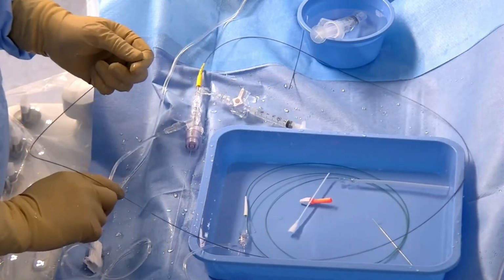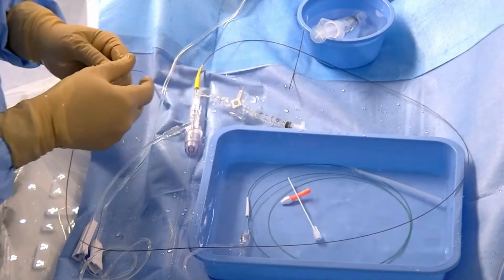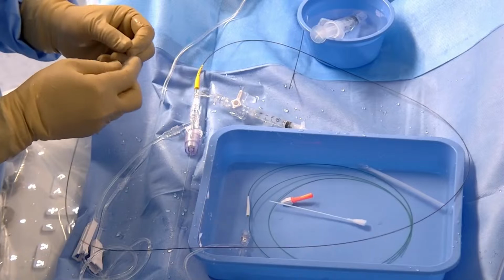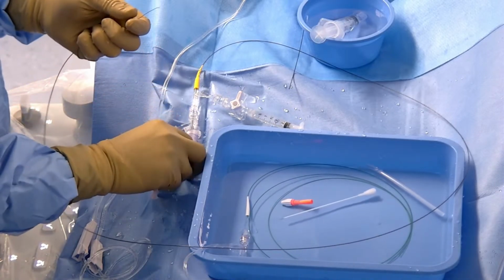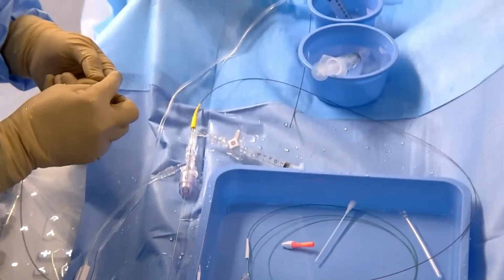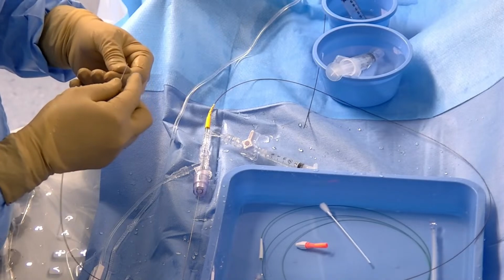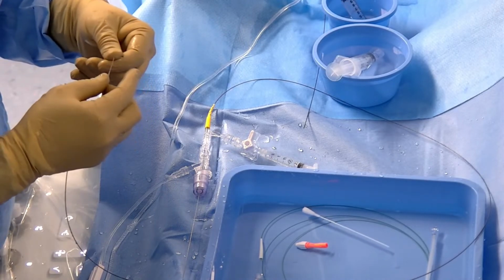We will see. Yes, this kink usually might be a problem for the guide wire navigation and the instrument pushability, but we'll see.